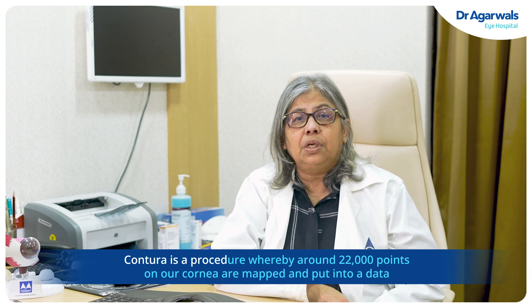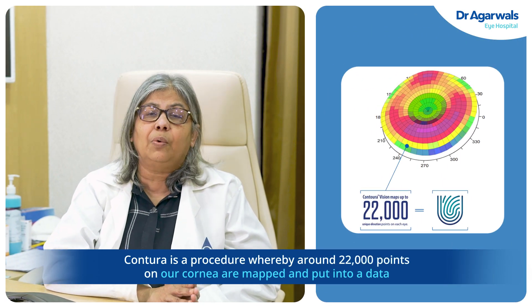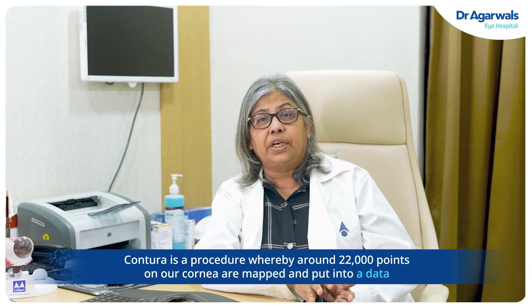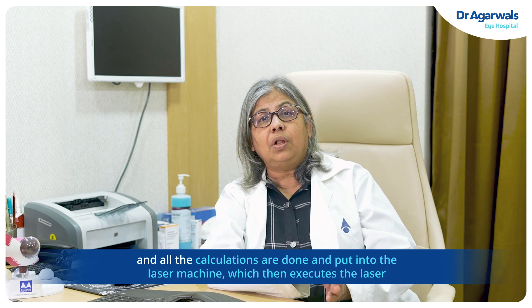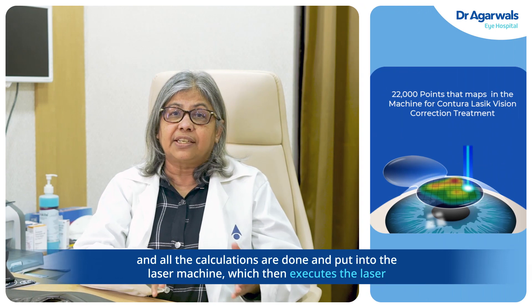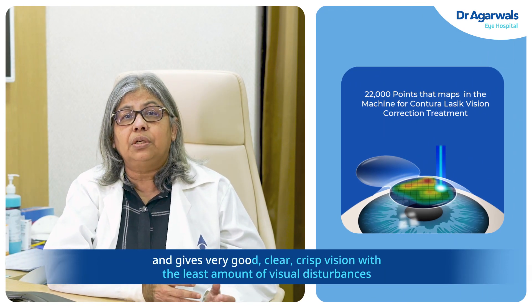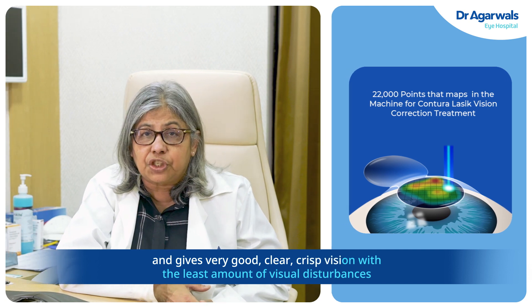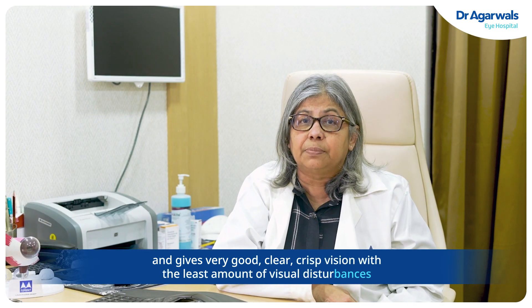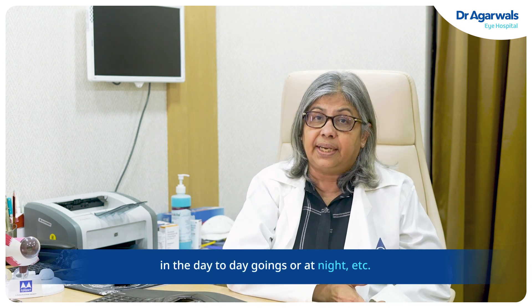Contura is a procedure whereby around 22,000 points on our cornea are mapped, put into data, and all the calculations are done and fed into the laser machine, which then executes the laser and gives very good, clear, crisp vision with the least amount of visual disturbances in day-to-day activities or at night.